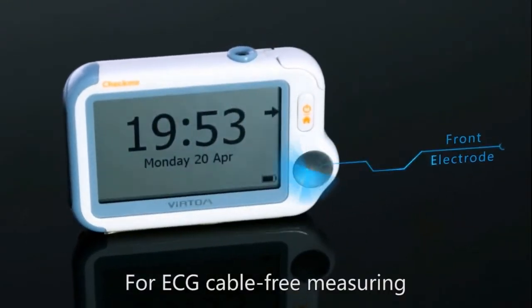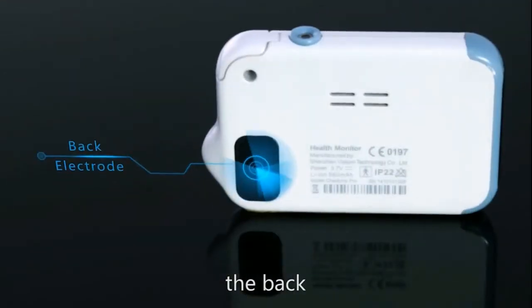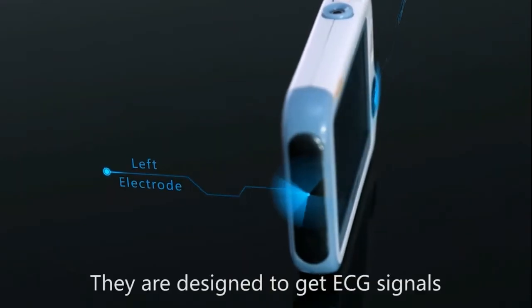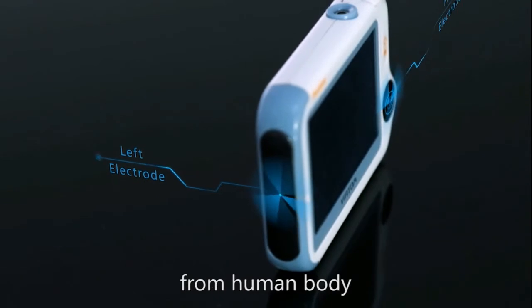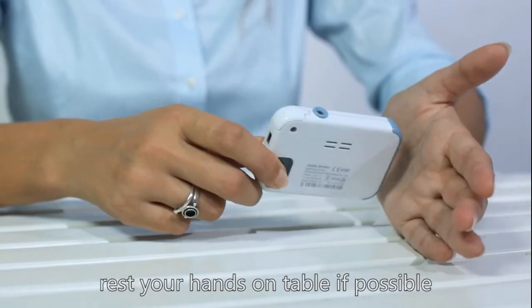For ECG cable-free measuring, there are three electrodes: the front, the back, and the left. They are designed to get ECG signals from the human body. To get stable ECG signals, rest your hands on a table if possible.